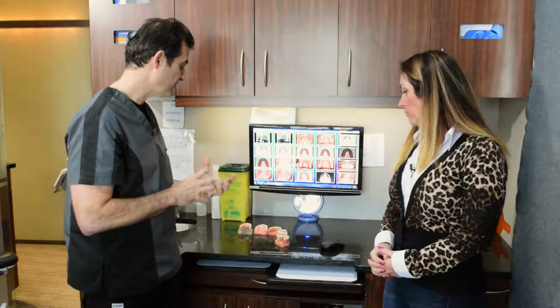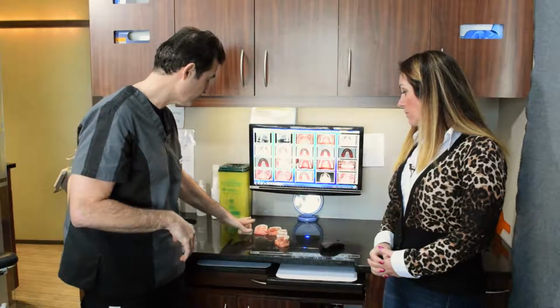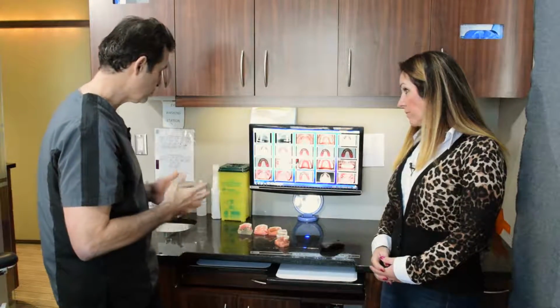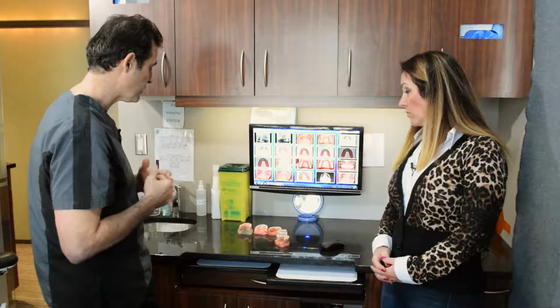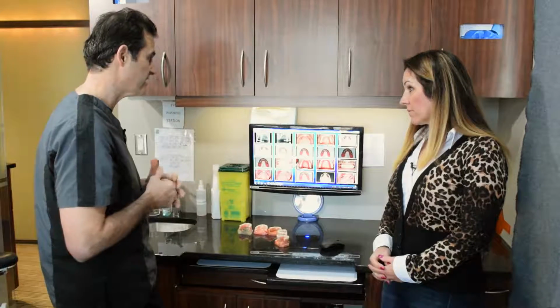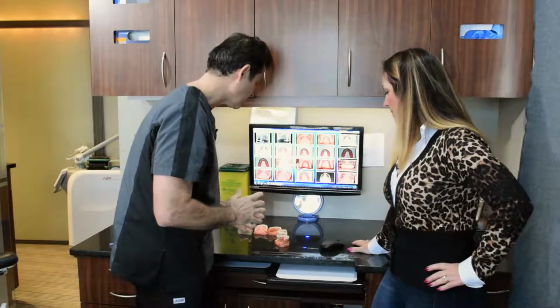But like I was saying, there's two materials we can make them out of. We can make a fixed denture, where we're screwing a denture down, sort of like the bar. And then we can also do a fixed porcelain bridge. Right. And there's advantages and disadvantages to both of those treatments. So I'll show you guys very quickly those two options, and then I'll probably do another video just on fixed teeth. Right. Because there's some very important details, and I don't want to drag this video out and make it into a 20-minute long video. Right. So let's talk about fixed teeth options for a moment.